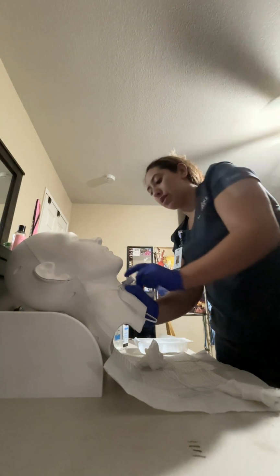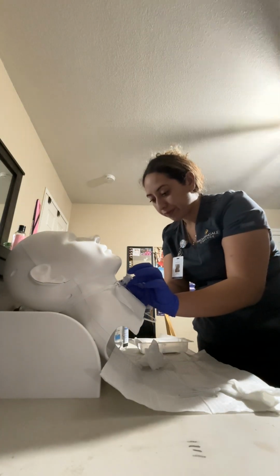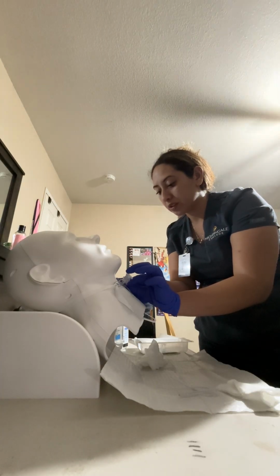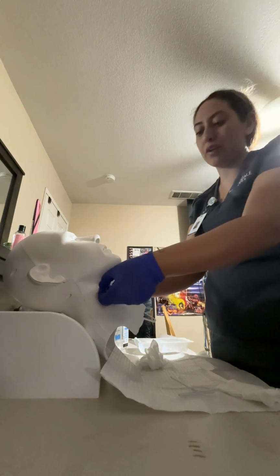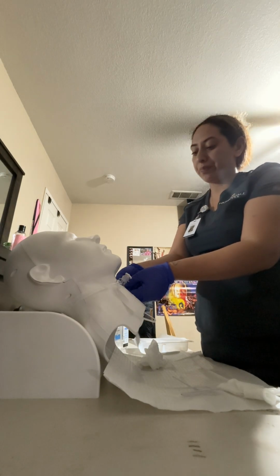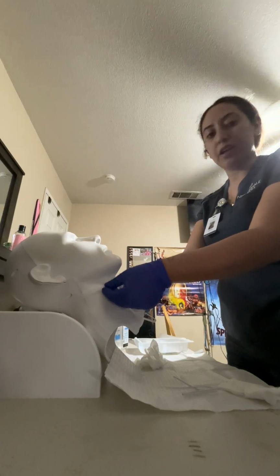Okay, I'm going to ask my patient to go ahead and lean forward for me. Bring this around. Ask my patient, are you doing okay? Patient says he's doing okay. So I am almost done here. Going to tie these. And I'm going to assure that I have at least enough space for about 2 fingers here. Have good enough space. I'm going to assure on this side, I can also fit 2 fingers here on this side. I'm going to tie my patient's knot. And I'm going to double check here, 2 finger spaces here, and the dressing is not too tight.